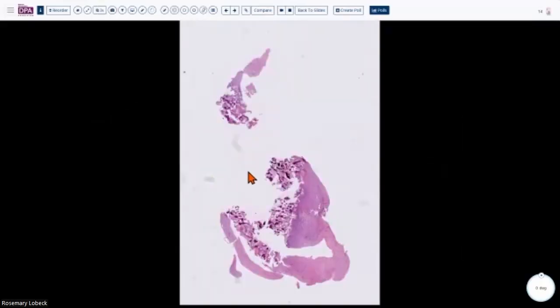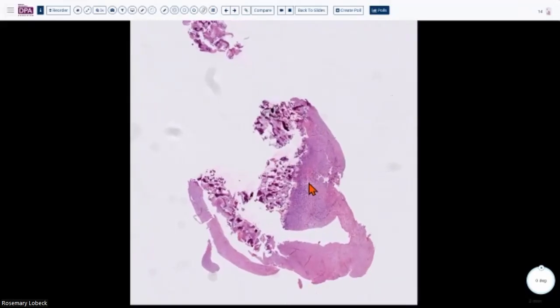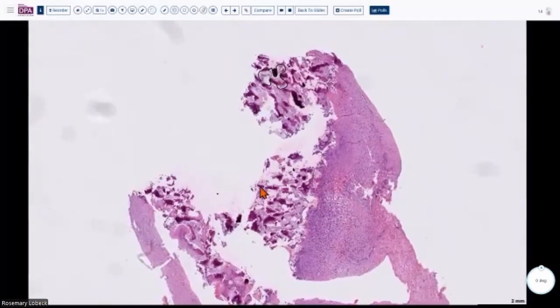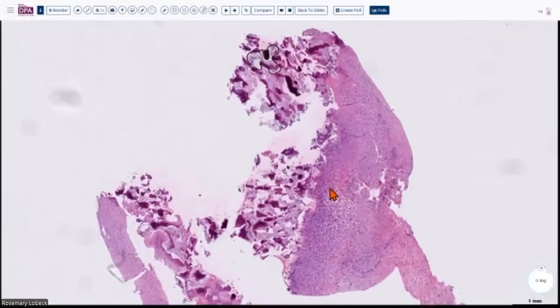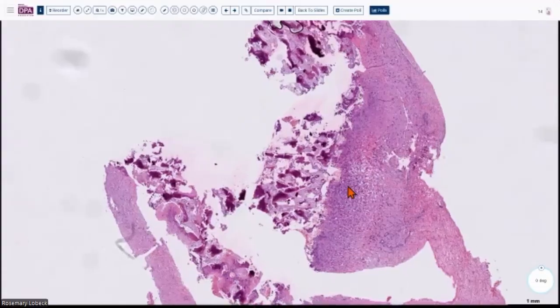I want to show you what we saw in the biopsy. So this is a biopsy. If you look at this from a scanner perspective, you will see that there is sort of a cartilaginous cap over here. And then you could see sort of a periosteum or perichondrium on top. And then from the cartilaginous cap, there is a bony outgrowth, which is essentially enchondral ossification, the same as what you will see in an osteochondroma. So nothing seems wrong with the diagnosis of osteochondroma on what we see in this biopsy, and it seems to correlate with the radiology as well.